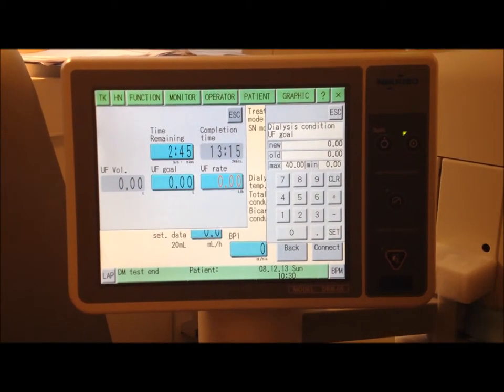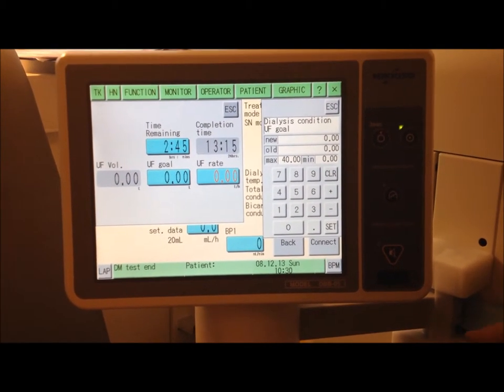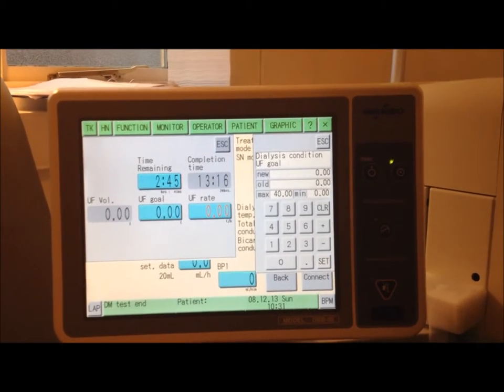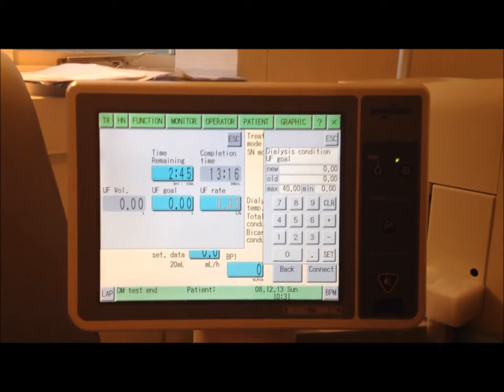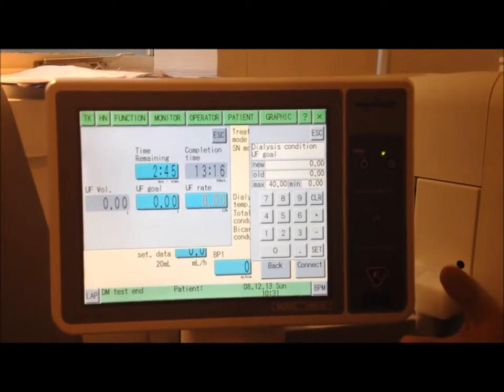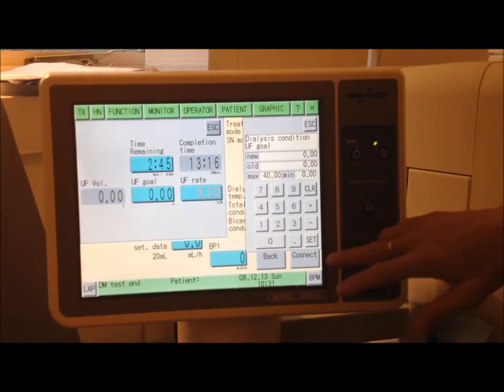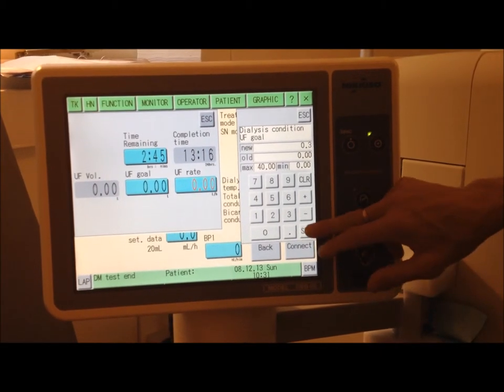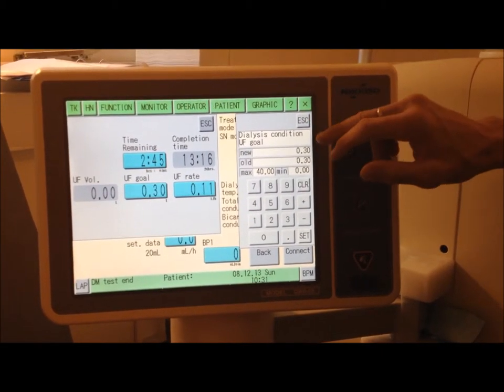UF goal — that's the amount of fluid that you're removing. Because I've got residual renal function, my kidneys are still doing some work, so I don't actually have to remove any fluid. But the minimum this machine will take is 0.3 of a litre. Set that, come out of that.